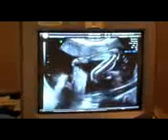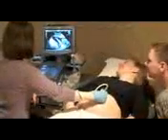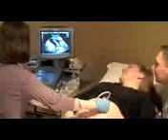We also, during the ultrasound, look at the limbs. We look to see that the bones are straight. We measure them for their length. Look at the fingers. See how many there are and that they are straight. That's amazing. If possible, families can find out if they're having a boy or a girl, and I know Sandy and Mike do not want to know that. So we'll keep that a secret.